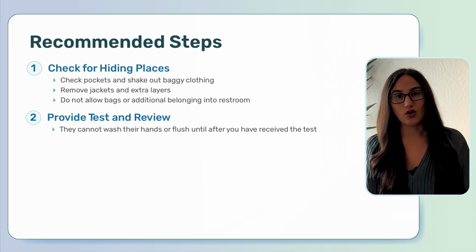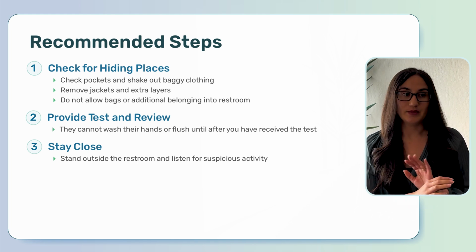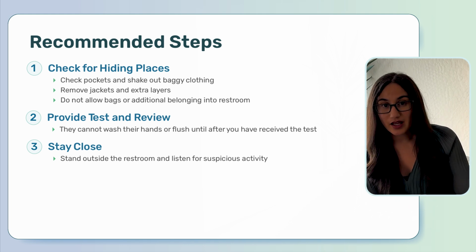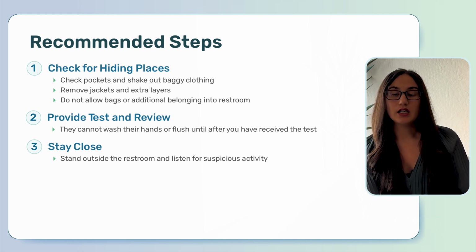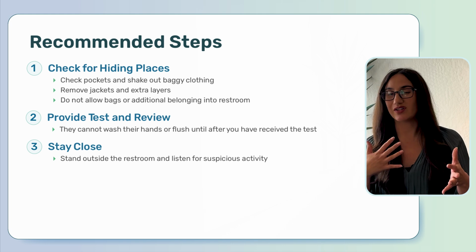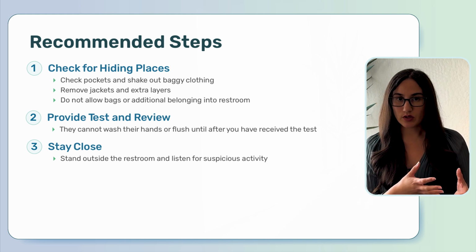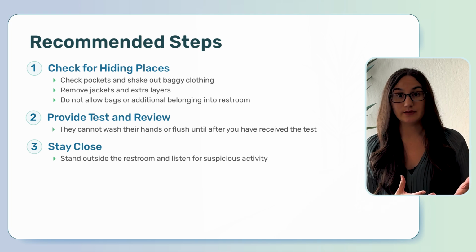This is also why I recommend standing outside of the restroom while they are taking their test. Now, I'm not saying you have to be in the bathroom with them or keeping the door open, but just making sure you are staying close and outside of that restroom. So if there is something going on in there that sounds abnormal, you can hear it.